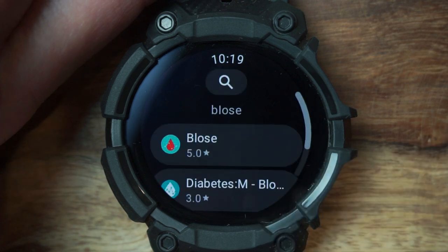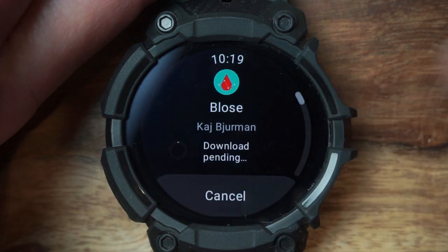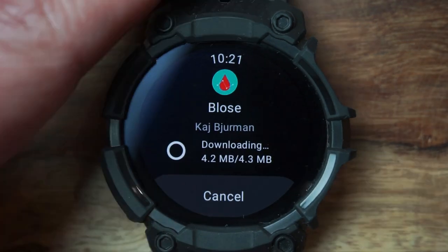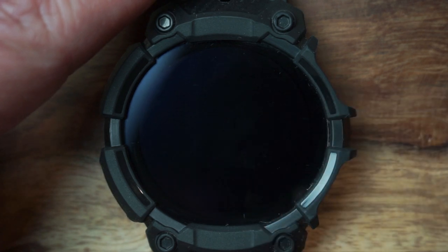The correct spelling is B-L-O-S-E — I hope I'm saying it right; if not, please correct me in the comments. As you can see, it's coming up and it's got a 5.0 star rating, which is great. Downloading and installing does take a while, so I'll speed it up for you. Let's open up the app.